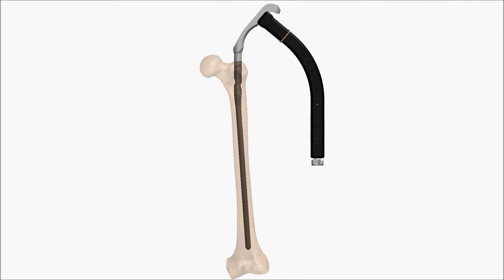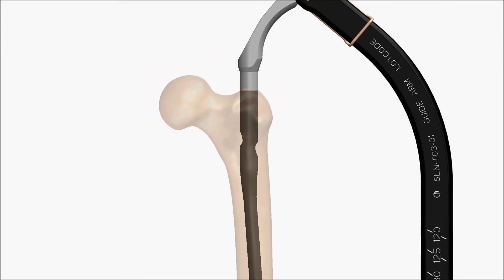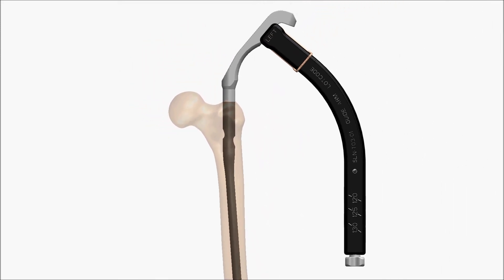Use the lag screw hole to fine tune the insertion depth of the nail. Ideal lag screw position is slightly inferior of center when viewed in the AP plane.